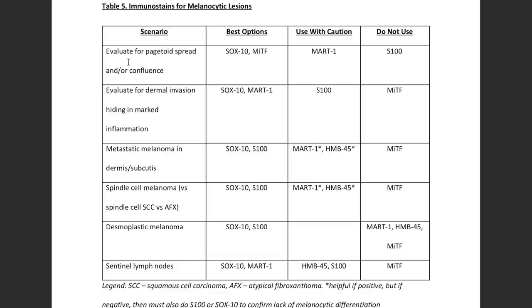There are of course exceptions to every rule. Even though I might normally want Sox10, I might choose Mart1 or something else in a different setting — it depends on every individual case. The remainder of the video is a series of lesions recorded as multiple video clips over multiple different days. I've done my best to arrange them logically, and hopefully these practical examples will give you a better understanding of how I use immunohistochemical stains for melanocytic lesions in my own practice.